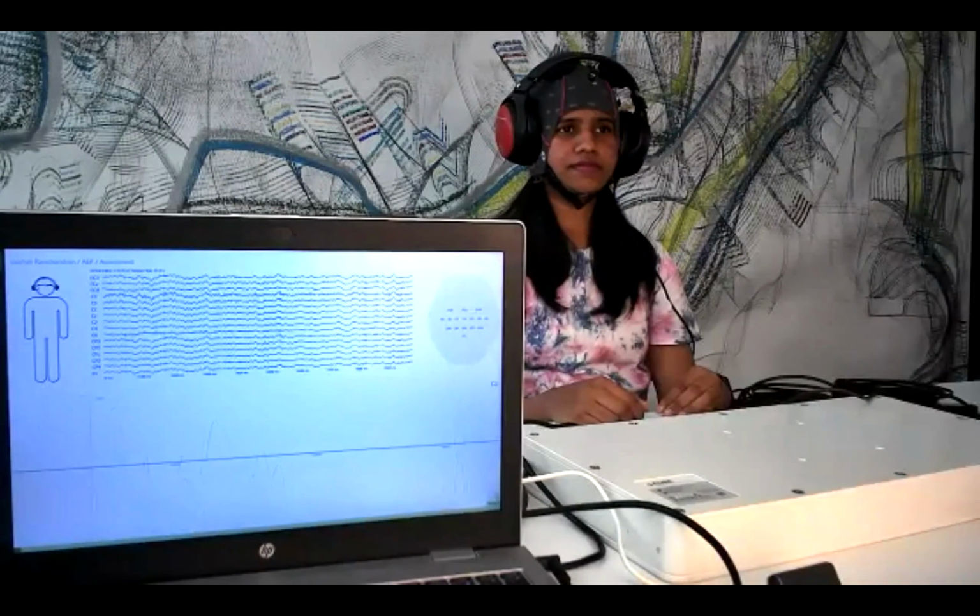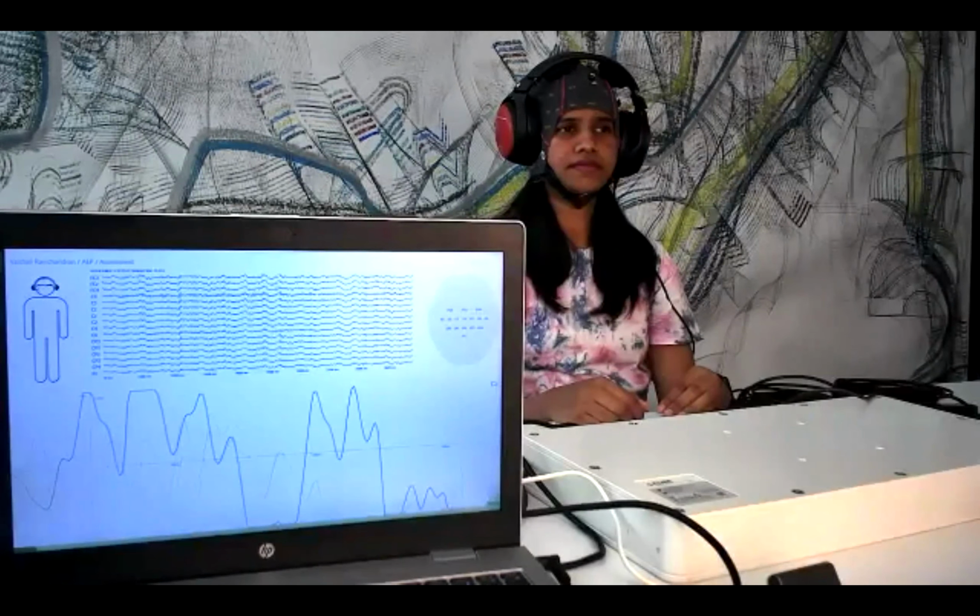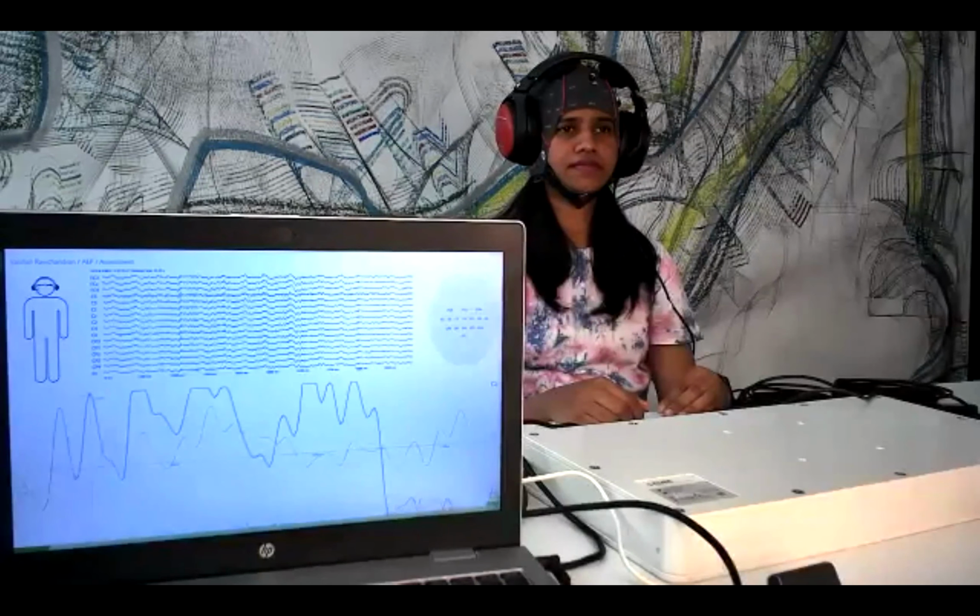So try not to talk and move too much, because this may cause additional artifacts. This EP will take around 4 minutes.